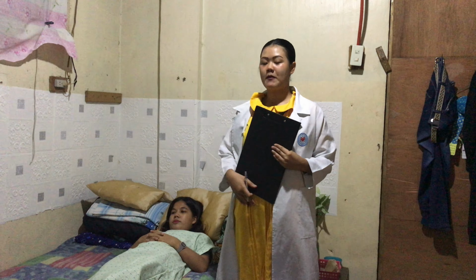So, first thing that we should know is our goal. What is the purpose of this assessment? This is to detect the levels of HCG, or the human chorionic gonadotrophin, in the female's urine that may indicate a probable pregnancy. The first thing that we should do in this assessment is to verify the procedure to be done on the client based on the doctor's orders.